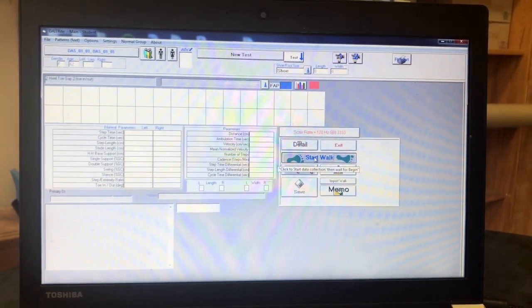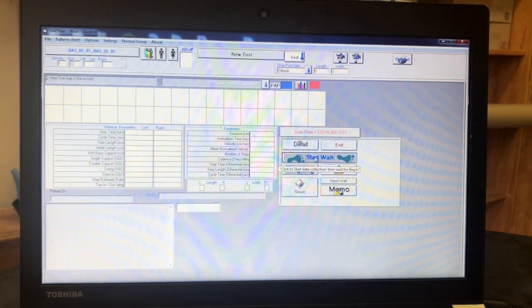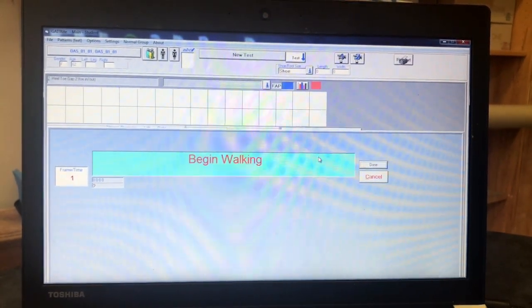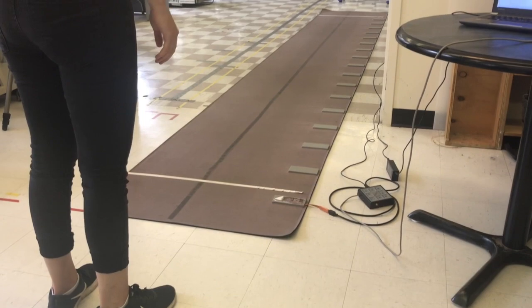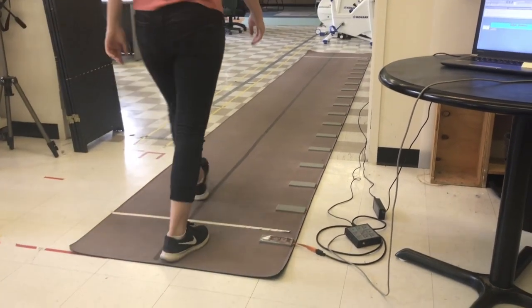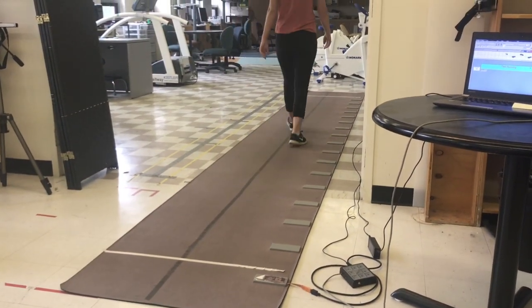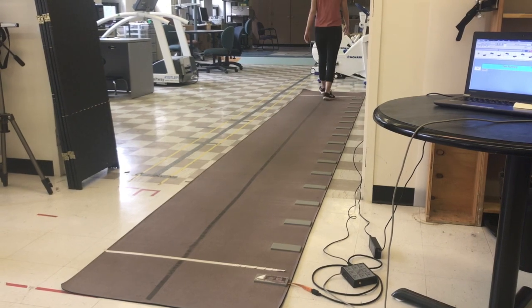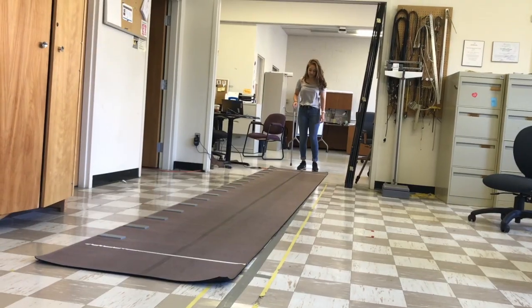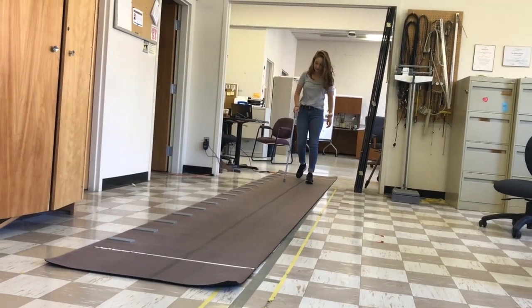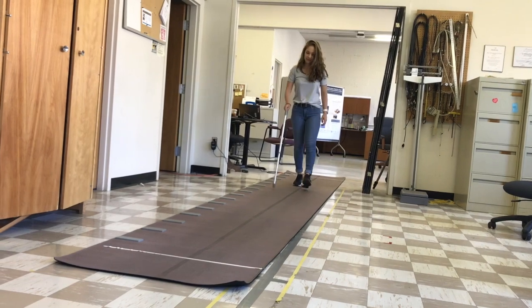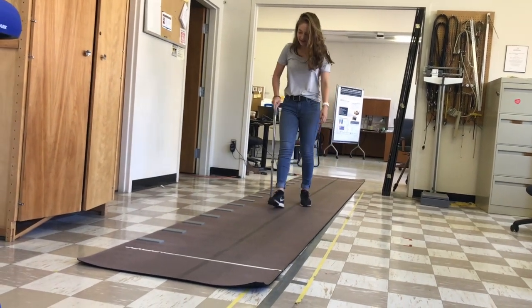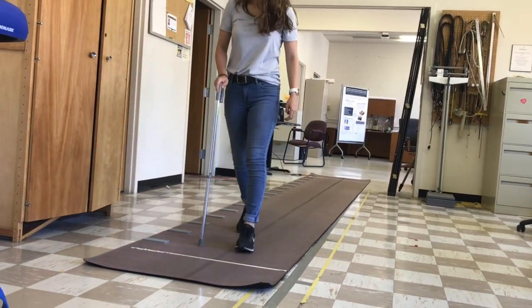Explain to the participant that this mat is full of sensors that will give us a better idea of how they walk. Instruct them that you want them to walk down the mat at their usual pace and usual speed, just as if they were walking down the street to go to the store. Tell them to use the black line running down the middle of the gate right as a guide to keep them away from the raised gray sensors running down the right side of the mat.